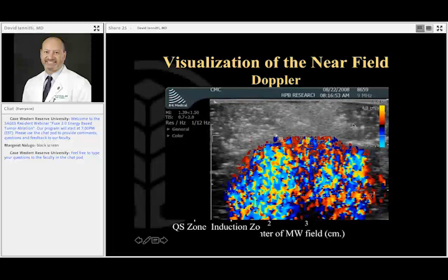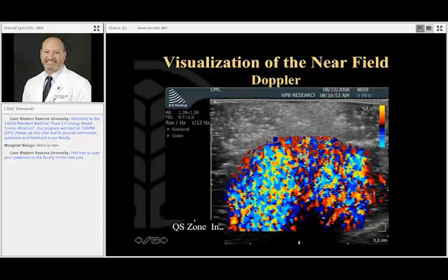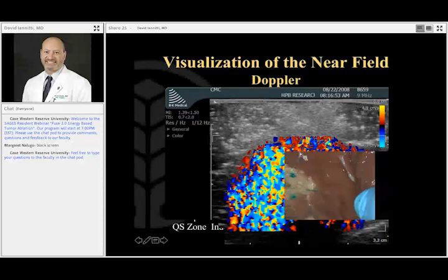That's what we usually set it at. So you can actually visualize in real time the near field effects of the microwave field, which is really cool. So if you really want to know if you're ablating something, you look at this. And we've, of course, correlated this in resected specimens and all this. Carl, we presented all of that.